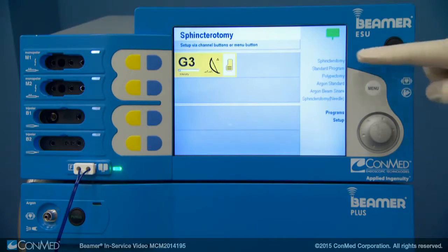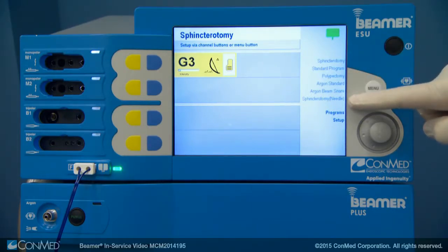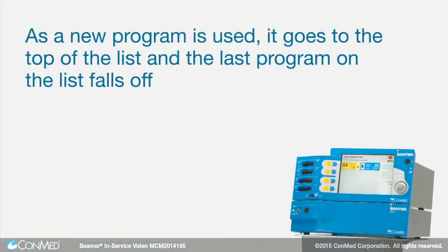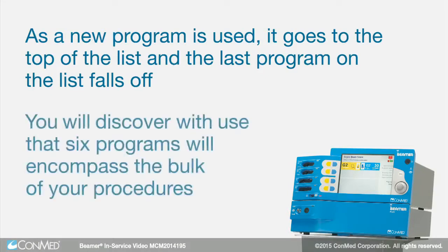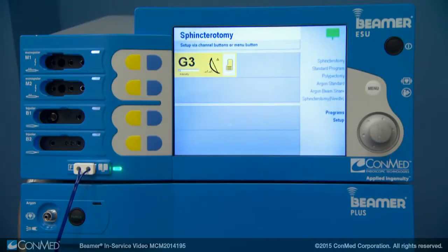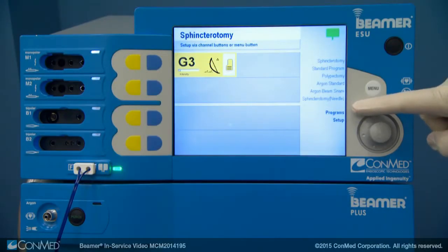This on-screen menu is a list of the six most recently used programs. As a new program is used, it goes to the top of the list and the last program on the list falls off. You will discover with use that six programs will encompass the bulk of your procedures. Below the list of programs are two other selections: programs and setup.